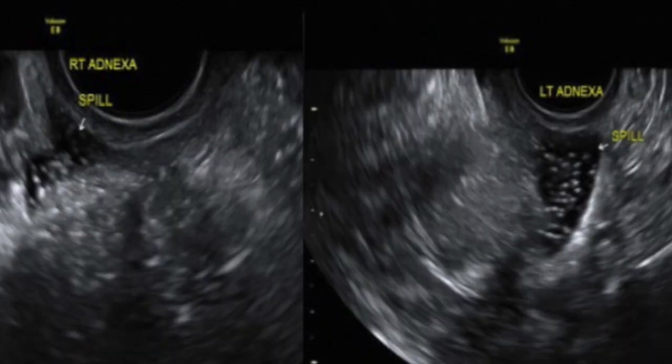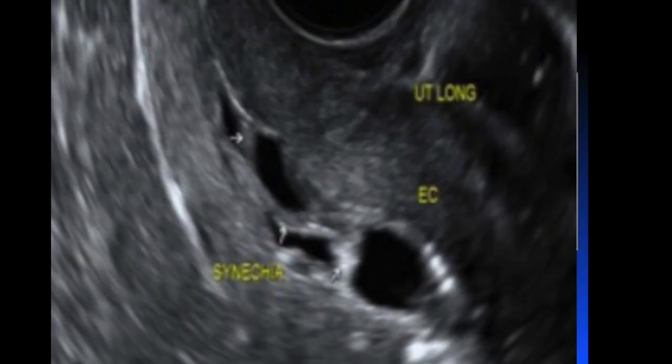This is a case with history of 3 failed IUI, and normal bilateral spill was seen in both the adnexa, which showed that the fallopian tubes were patent. An examination of the endometrial canal after instillation of saline showed presence of thick synechiae within it, which was the cause of the infertility and the failed IUI.